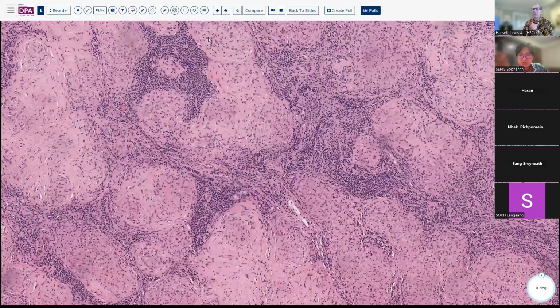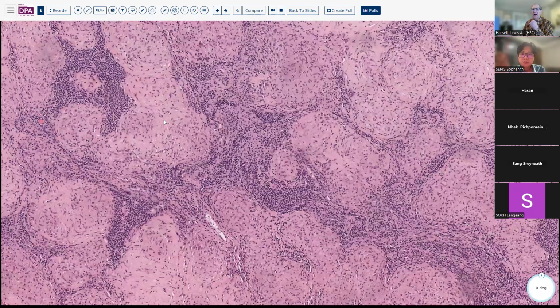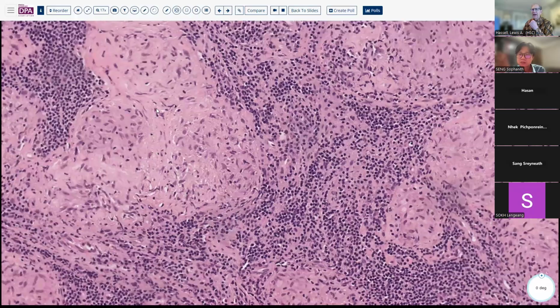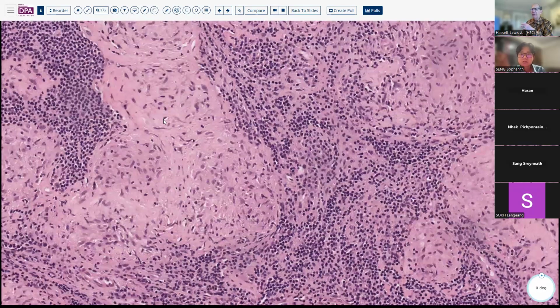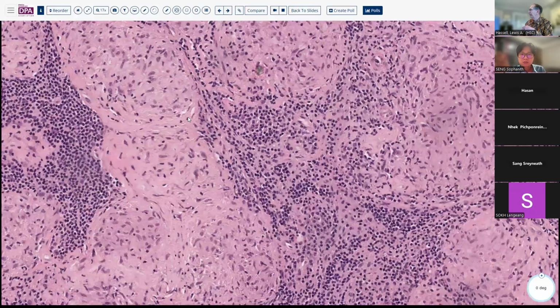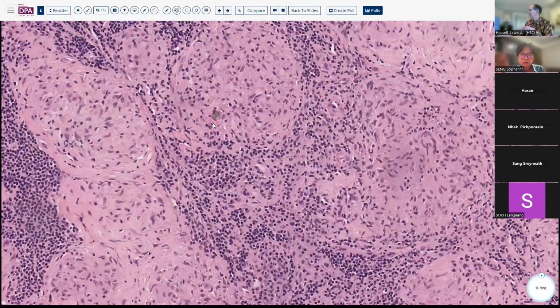In other words, patients who are exposed to silicates, either through hard rock mining or through various industrial exposures, can also develop a hyalinizing granulomatous-like lymph node appearance. And those are cases where doing polarized light exam can be very instructive. It's a very cheap and simple way to examine these nodes, looking for the foreign material.